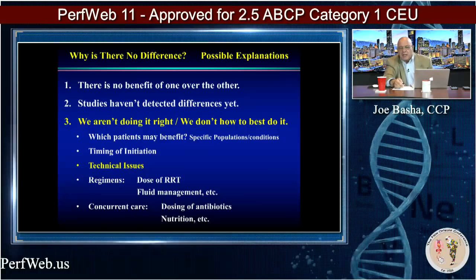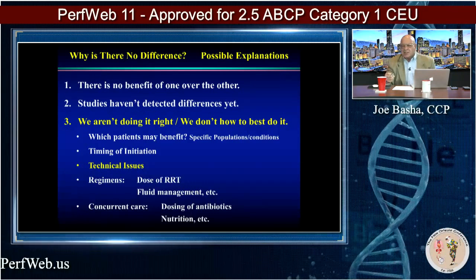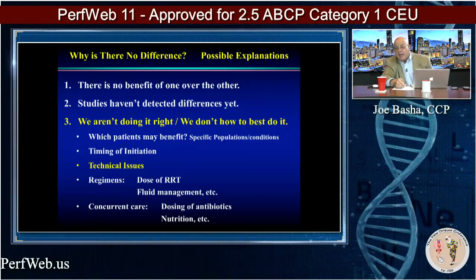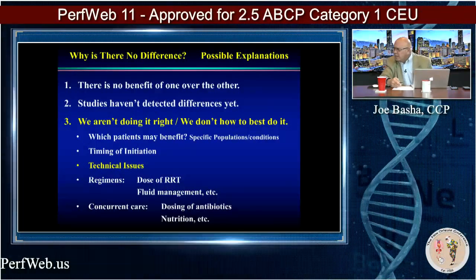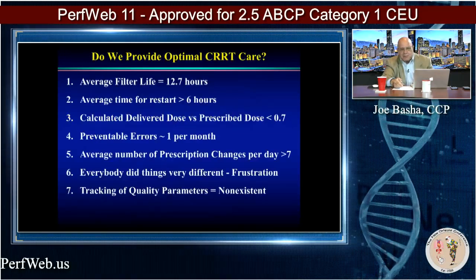Technical issues, of course, play a role. Regimens: what's the dose? What's your fluid management? And dose is measured in CRRT with effluent dose, and I'll explain that as we move forward here. Concurrent care also, dosing of antibiotics and nutrition. Remember I told you, you remove not just the pro-inflammatory mediators, you remove the anti-inflammatory mediators too. And also you remove antibiotics and you remove nutrition. So you have to compensate for that as you use this therapeutic modality.